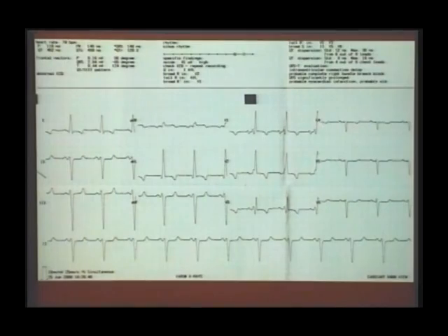So, any ECG recording like this, you must see that in the bottom you would have this vertical bar saying 1 millivolt standardization or 10 millimeters per millivolt, and the speed of recording is 25 millimeters per second. Without making sure of this point, you are not supposed to interpret and diagnose ventricular enlargements, bundle branch blocks, durations and so on.